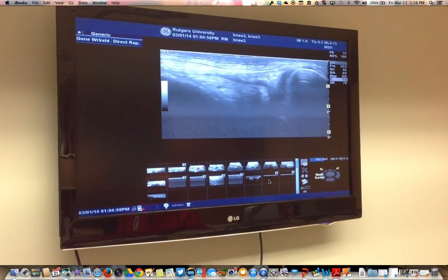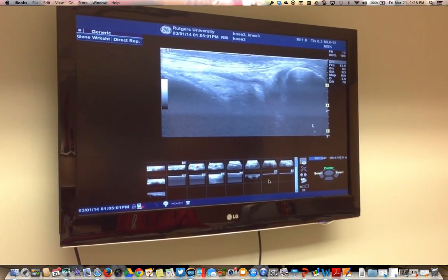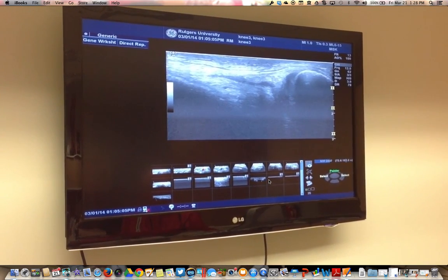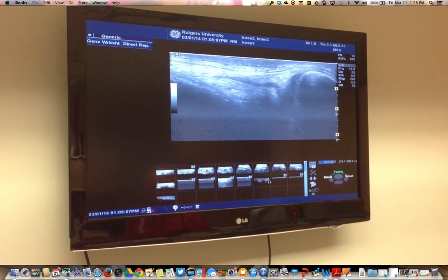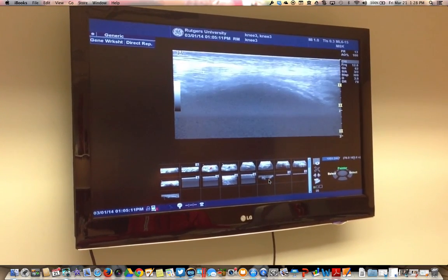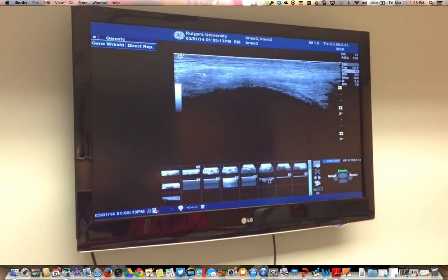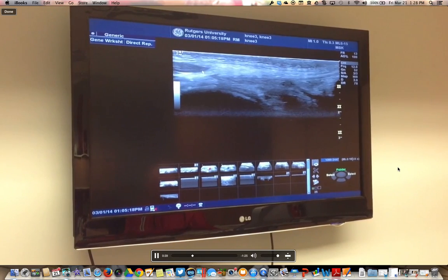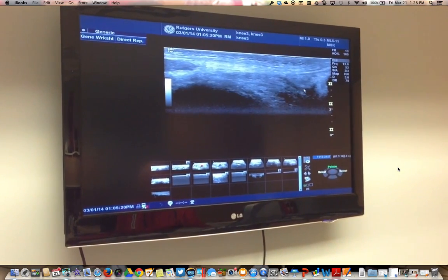The retinaculum is a bilayered structure sitting in this zone, sitting directly on top here, connecting here, and running all the way across to its attachment into the adductor tubercle. Sitting below it is part of the joint capsule, which we visualize here.